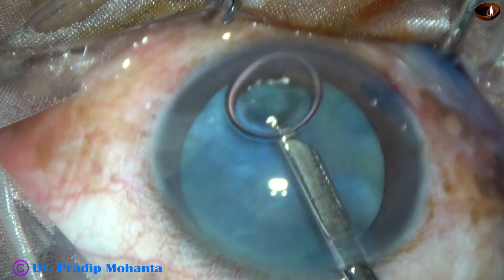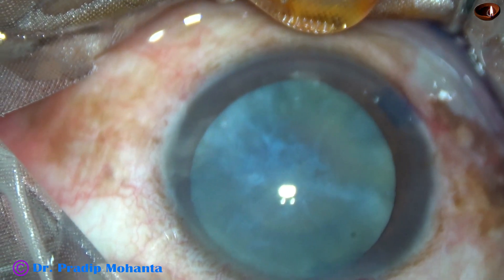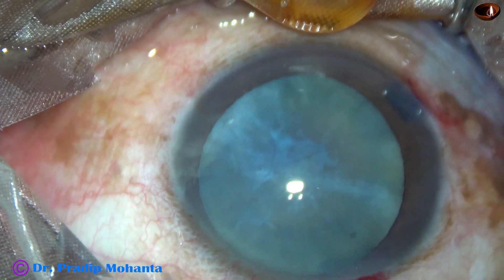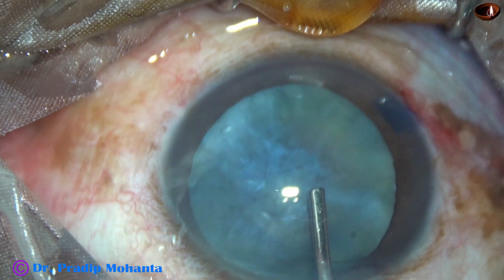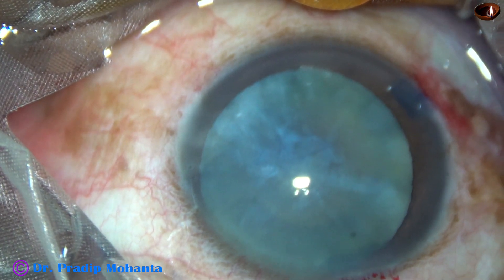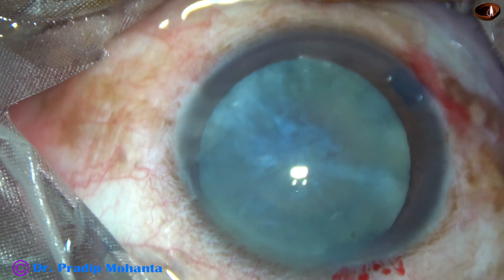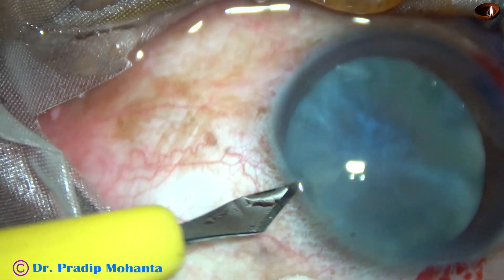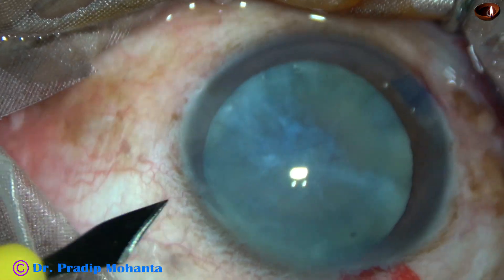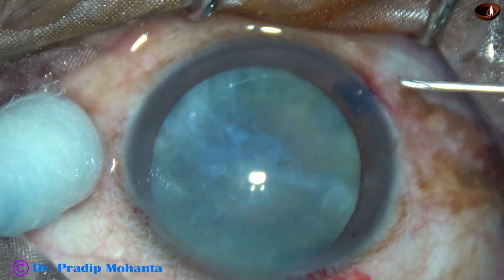The dye is washed out with a Simcoe cannula and now the anterior chamber is filled up with 2% hydroxypropyl methyl cellulose. We can see fibrosis beneath the anterior capsule at the center, and it is going towards 4 o'clock and 5 o'clock.